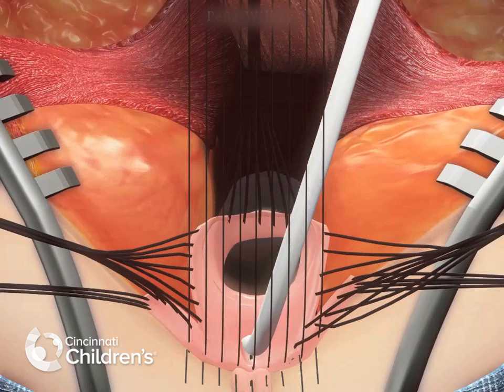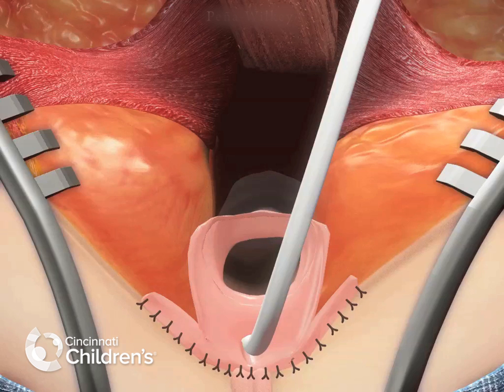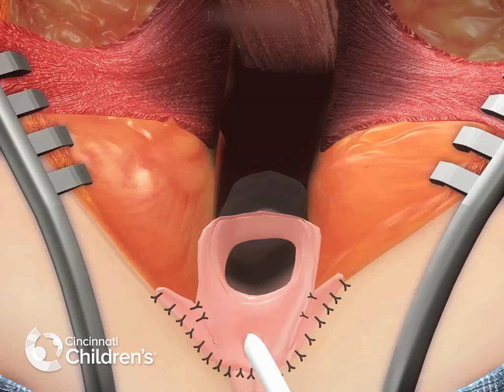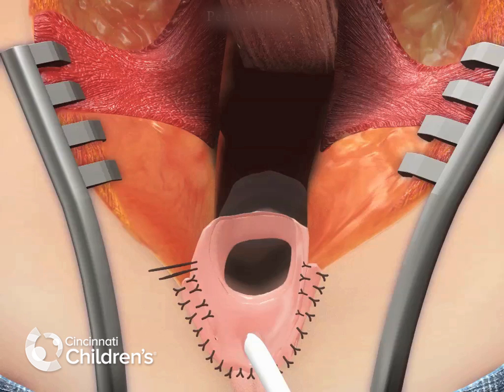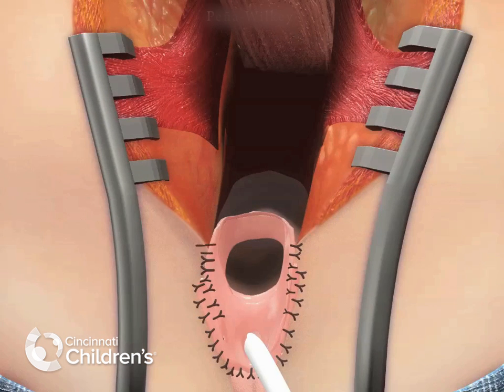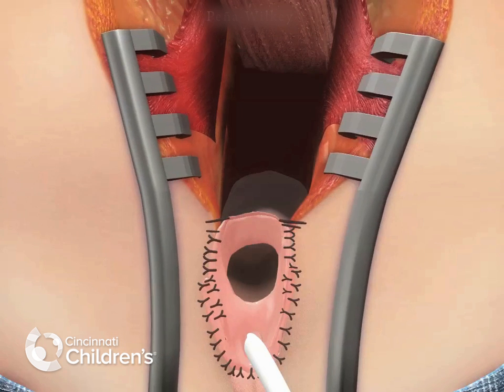The previous common channel has now become labia minora. And here you see the introitoplasty portion of the cloaca repair, where multiple interrupted sutures are placed as traction is released to create the vaginal introitus.